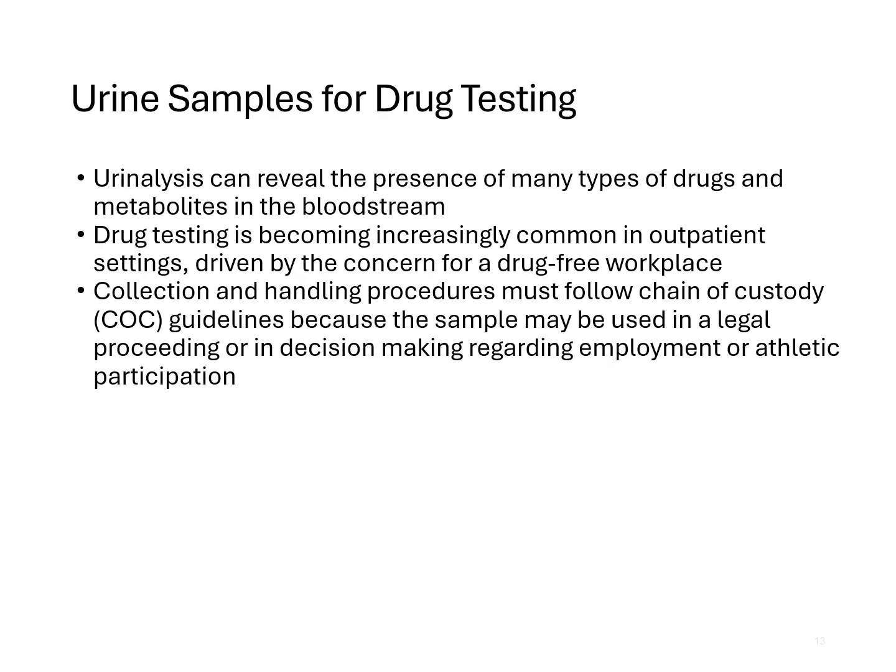Urine samples for drug testing. Urinalysis can reveal the presence of a whole bunch of different types of drugs and certain metabolites in the bloodstream. Drug testing has become pretty common in outpatient settings that are driven by the concern for a drug-free workplace. So a lot of places, especially if you work in an outpatient doctor's office or something, you may be collecting drug testing on patients. So just know that you might have a part in this. Collection and handling procedures must follow that chain of custody that we talked about earlier, because the sample may be used in a legal proceeding or in decision making regarding employment or athletic participation.